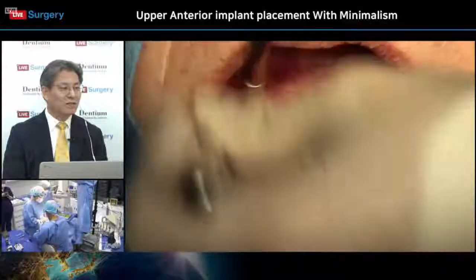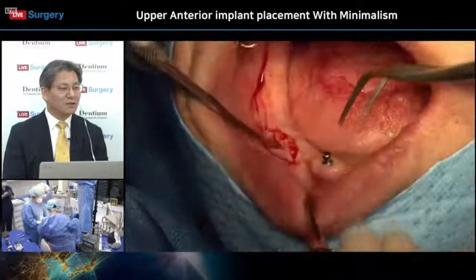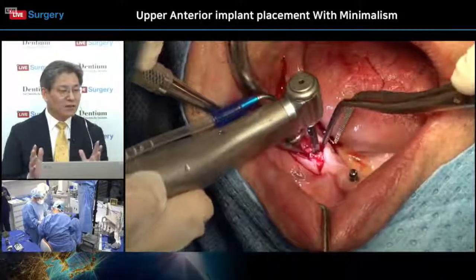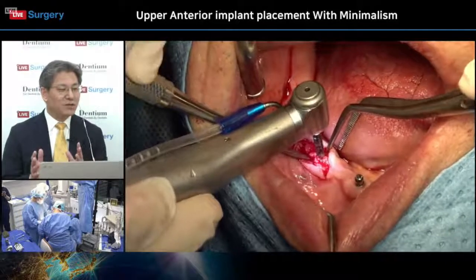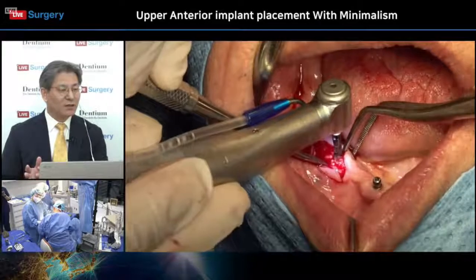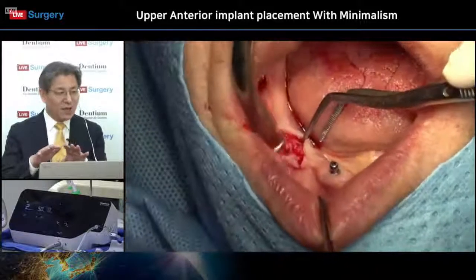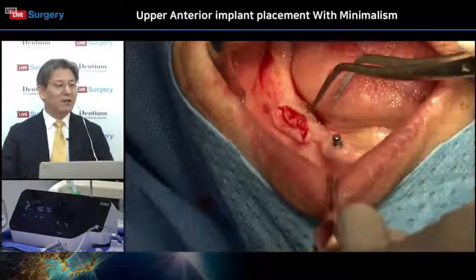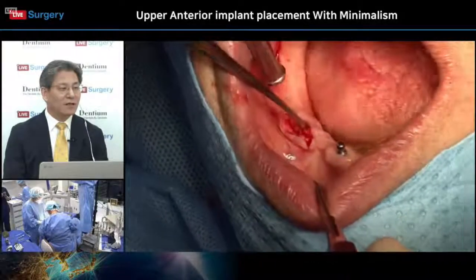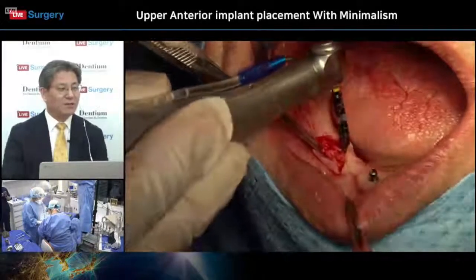Yeah. About the overdenture, the implant supported overdenture style, the two key factors are important. First one, the parallelism of each implant fixture. Each implant fixture should be installed in parallel, right? And number two, the same level. If you can, try to make the implant platform level the same, which is much better.